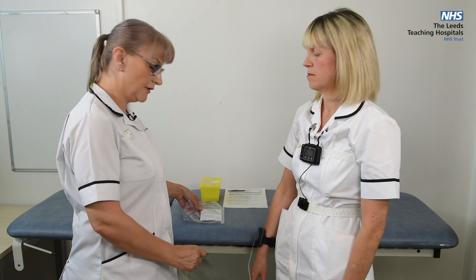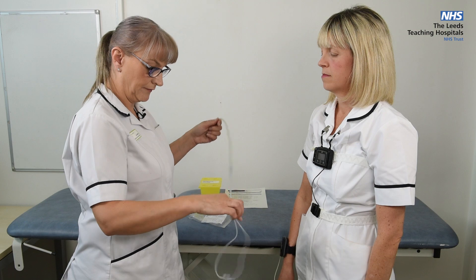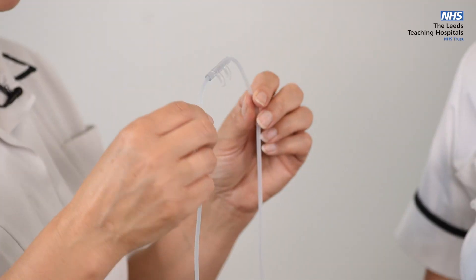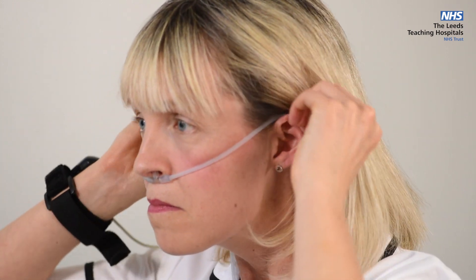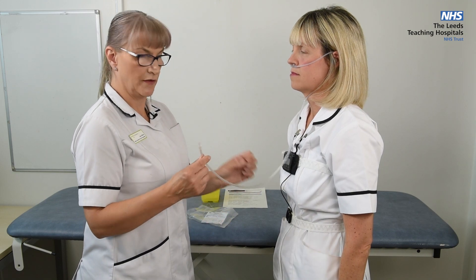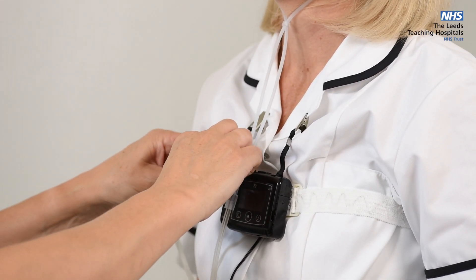The nasal cannula — remove from the package. Ensure that the prongs are facing forwards and place into the nose. Follow up over the ears, down under the chin, and then adjust the toggle up to the chin to secure. Then attach the end of the tube to the tube on the side of the box.